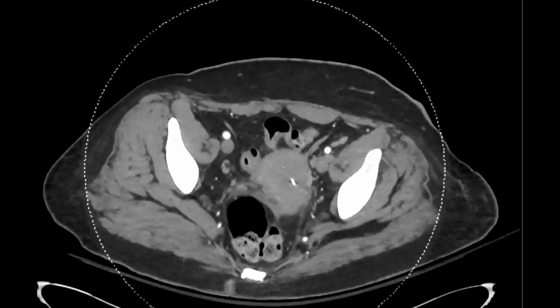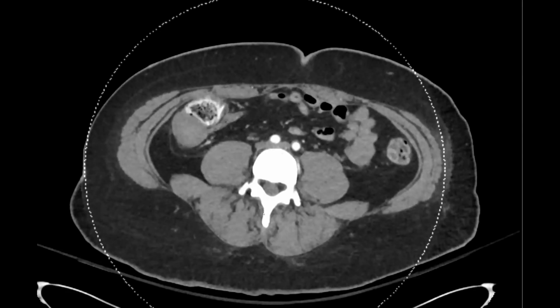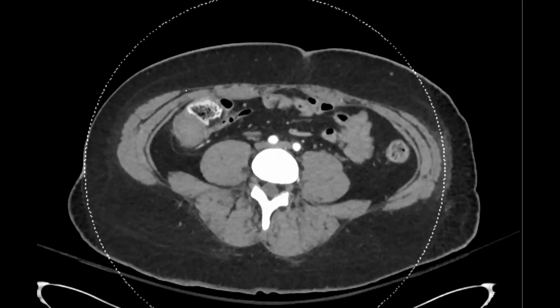And I showed you that that patient had a lot of vascular disease. They even had critical limb ischemia. And so they were on anticoagulation. And so we think that this was actually just a spontaneous submucosal hematoma from their anticoagulation. Kind of rare, but it even looked like that on the CT, kind of bland looking. So, don't jump to the conclusion that every mass affiliated with the colon is a tumor necessarily. Especially patients on anticoagulation, they can bleed wherever. So they ended up doing a colonoscopy and biopsy, and this was negative.